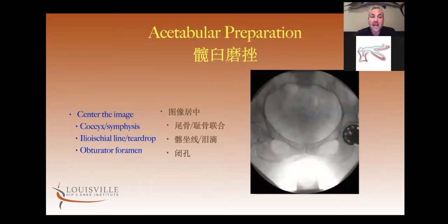When preparing the acetabulum, I like using fluoroscopy both to ream and to insert the acetabular component — it provides a way to ideally position the reamer and component exactly where I want them. Before I do anything, I want to make sure the pelvis is level to the floor. I bring in the x-ray over the center of the pelvis, look at the relationship of the pubic symphysis to the midline of the sacrum, and the shape of the obturator foramen.